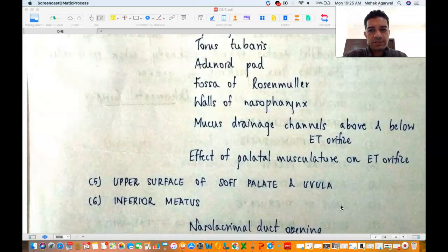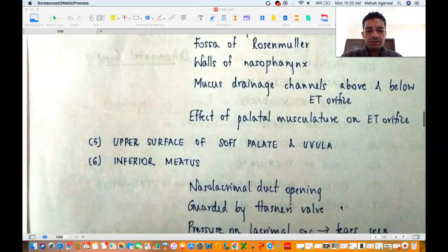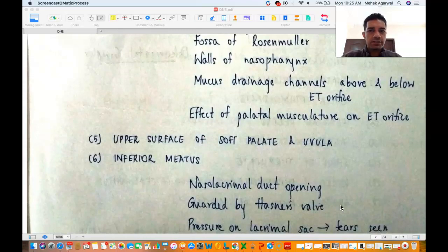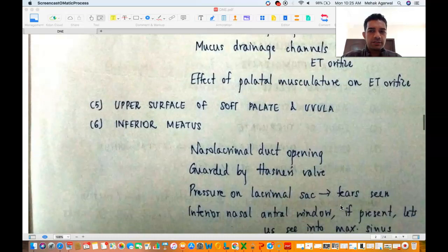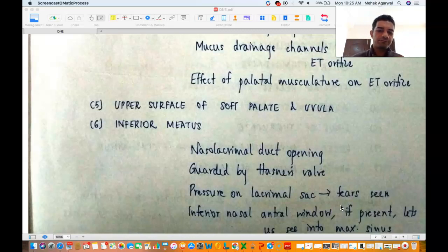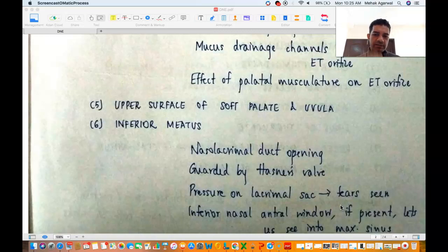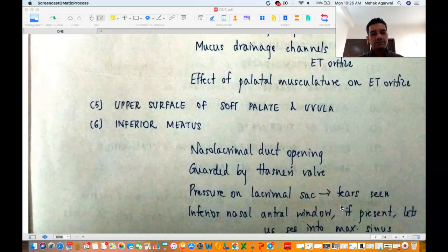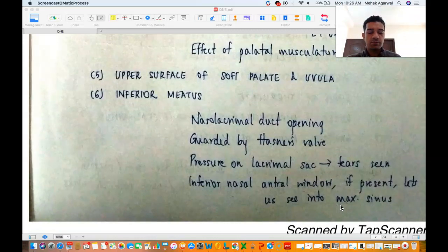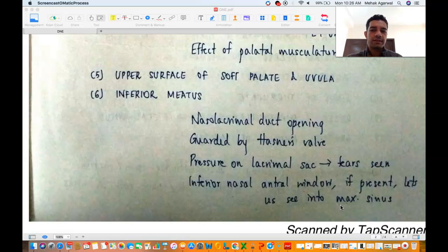The inferior meatus is just lateral to the inferior turbinate. It has the nasolacrimal duct opening, usually guarded by Hasner's valve. If you put slight pressure on the lacrimal sac, tears can be seen coming out through Hasner's valve. If an inferior antrostomy has been done, you can see an inferior nasal antral window — a connection between the nasal cavity and the maxillary sinus through the inferior meatus. Using an angled endoscope through this window, you can see the interiors of the maxillary sinus.